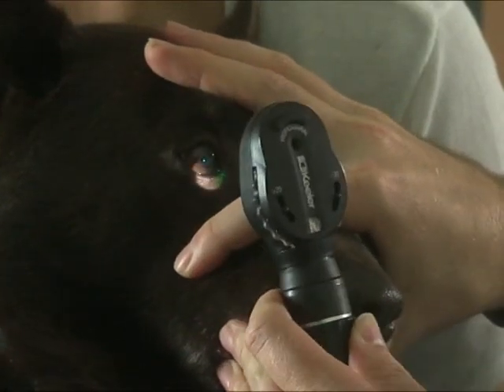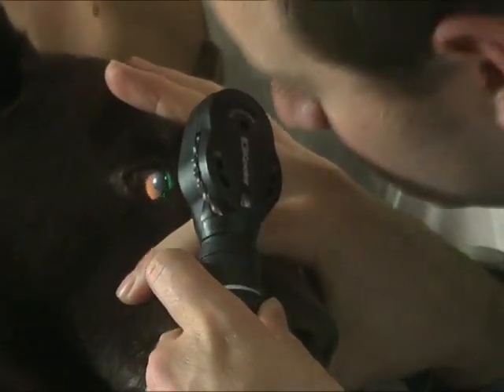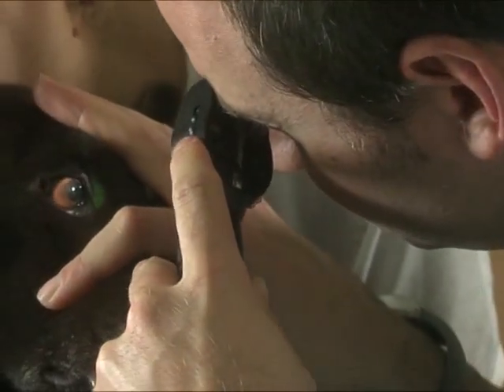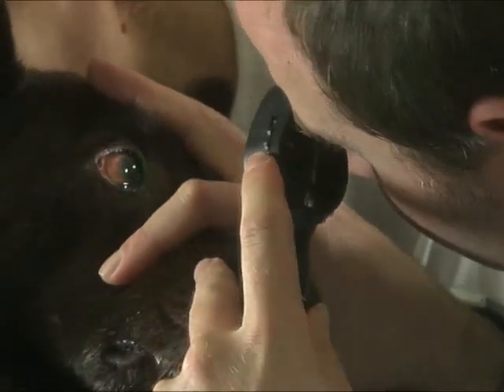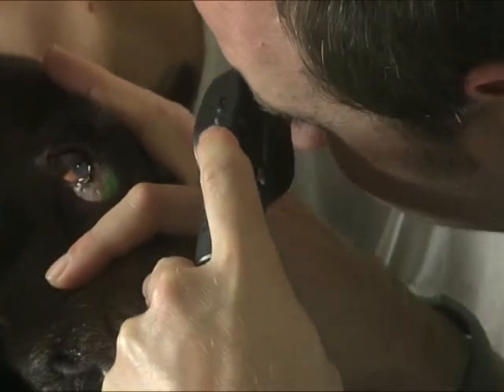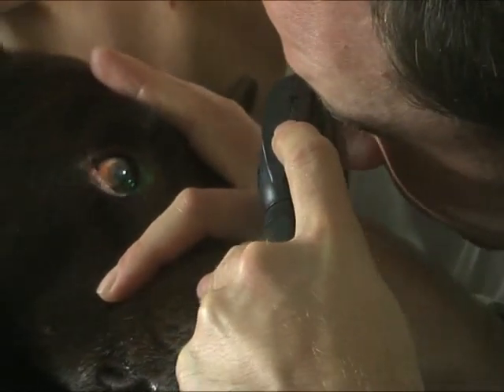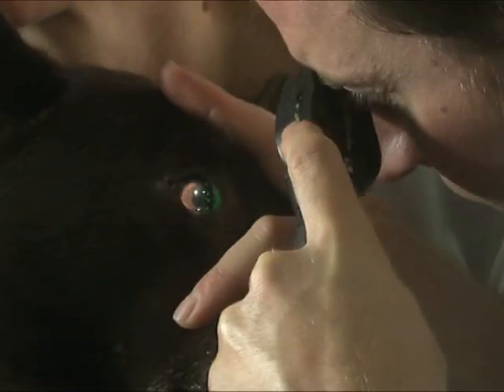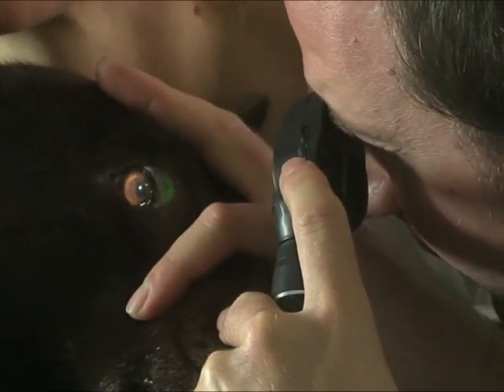And the technique that you apply then is to have the ophthalmoscope in the exact same position, but you need to bring your head in at an angle over the top of the dog's nose. That way you will minimally interfere with your ability to explore the whole fundus and ensure you don't leave areas unexamined.